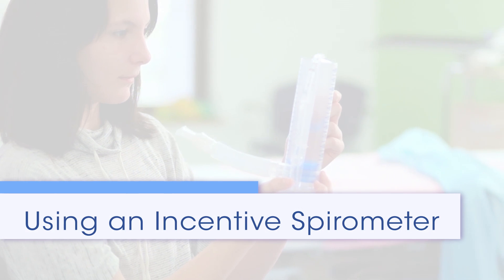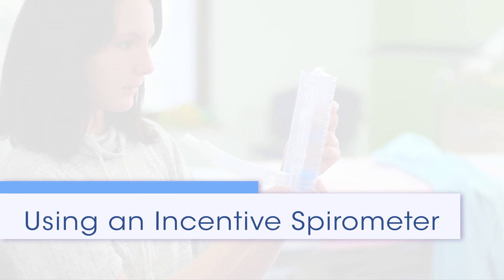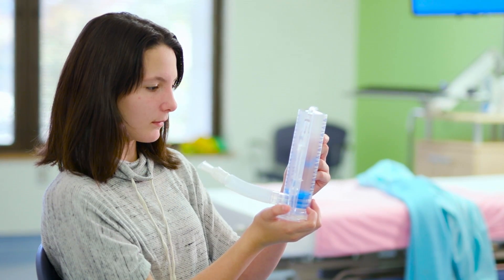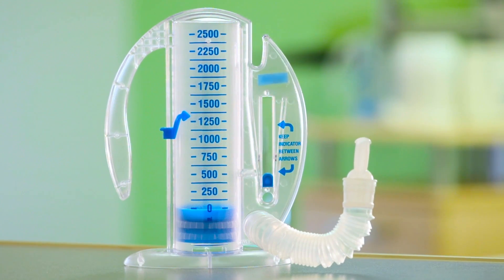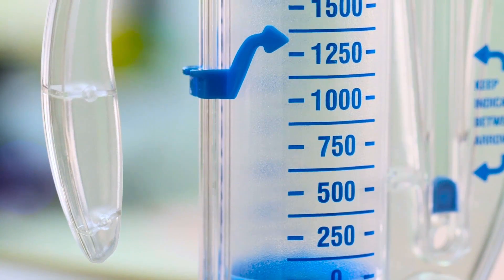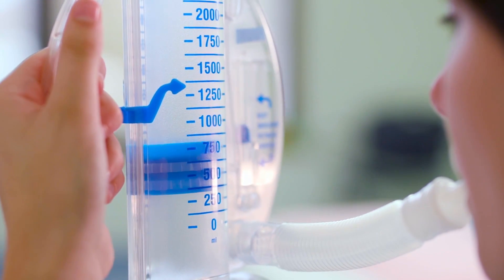An incentive spirometer is a device that helps you take slow, deep breaths. Using it correctly keeps the lungs working well and can help prevent problems like pneumonia. An incentive spirometer is made of hollow, clear plastic and has a tube with a mouthpiece attached. Numbers on the spirometer show how deeply you breathe in.